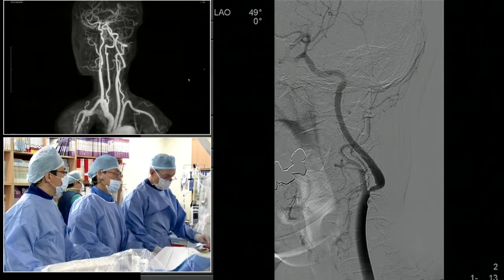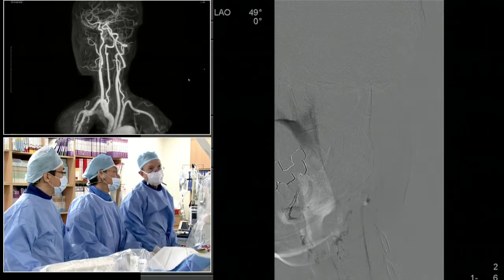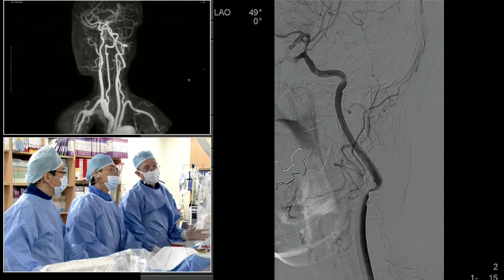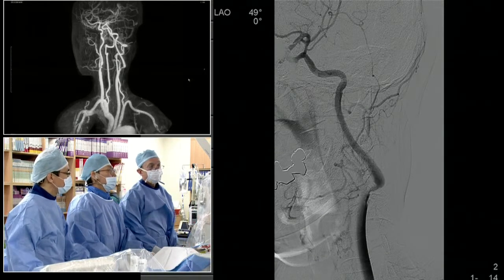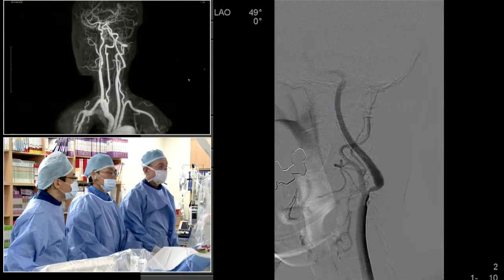Great question. I did not ask which is really dominant. By angiography, we took an angio which demonstrates that there is no crossover on the left. So angiographically, the distribution is pretty equal. As far as whether she's right or left dominant, I don't know.